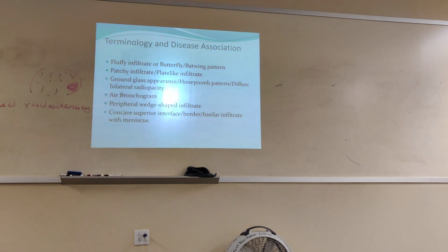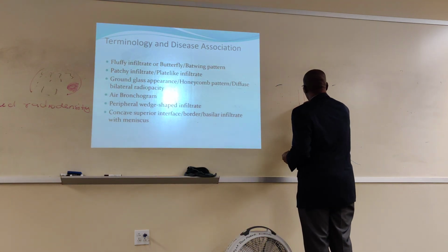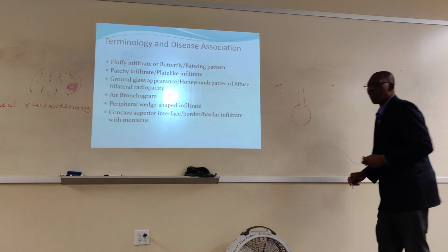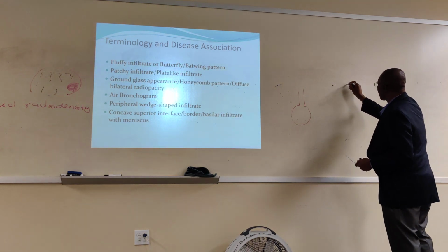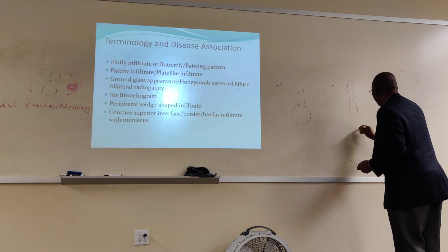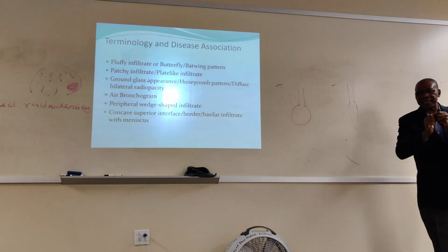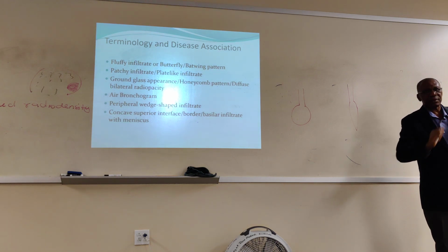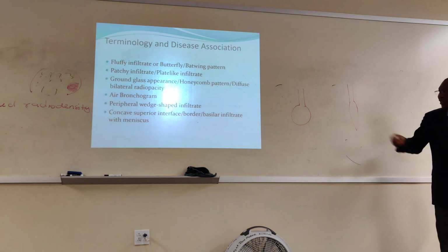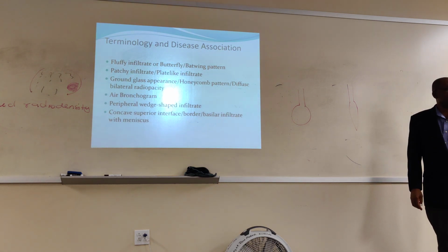An air bronchogram means pneumonia. Okay? Now, a bronchogram is like, here is the normal lung unit here, normal alveolus. So now you get pneumonia, now you have exudate and secretions flooding in here, so that kind of distends the lung like that. Distends the lung, the weight of the fluid inside the alveolus is going to make it stretch. That's what a bronchogram is.